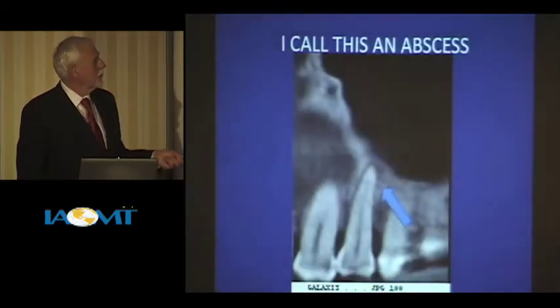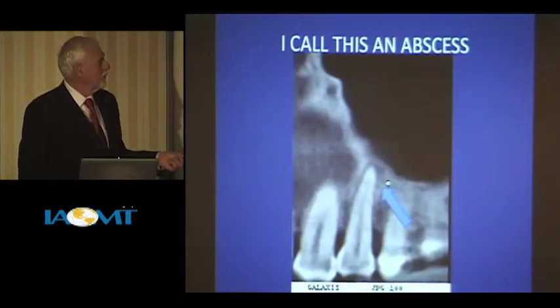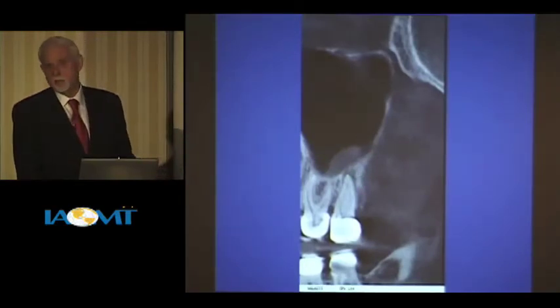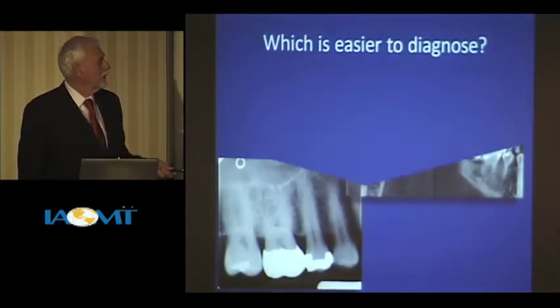However, one of the points is the CAT scan, I mean, you strap their head in. It only takes 14 seconds. It's very rare to not get a very good CAT scan. That's an abscess. Look at this. Small abscess here. Look at the sinus. Is that an accident or is that unrelated? Probably not. Which is easier to diagnose, little lesions here, or you look over here? Pretty easy.